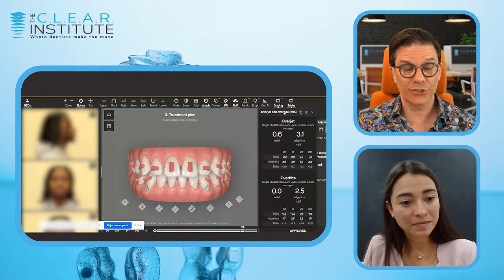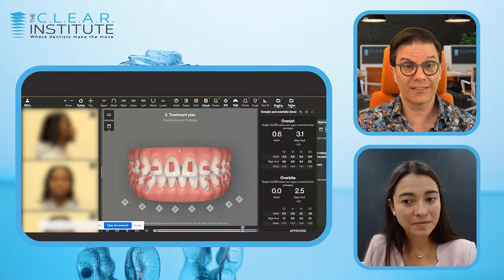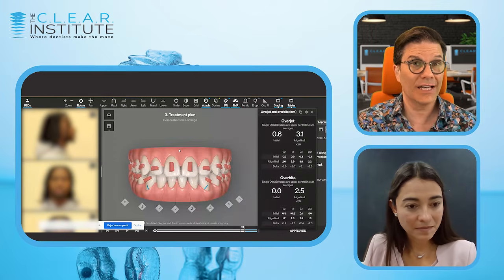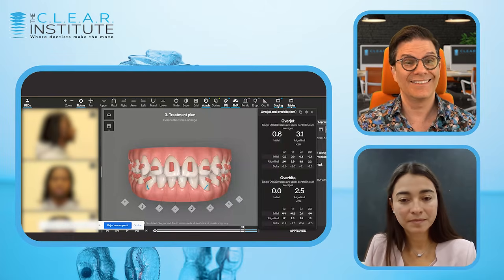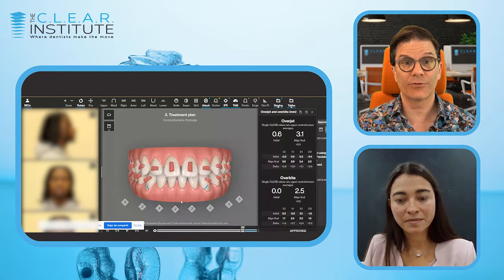But make sure, and sometimes it's even easier if you're a general dentist, a lot of times you have these patients in your practice. They come back for their regular checkup, and so take the time, scan them, take x-rays, take measures, take pictures, and just monitor your patient over time.